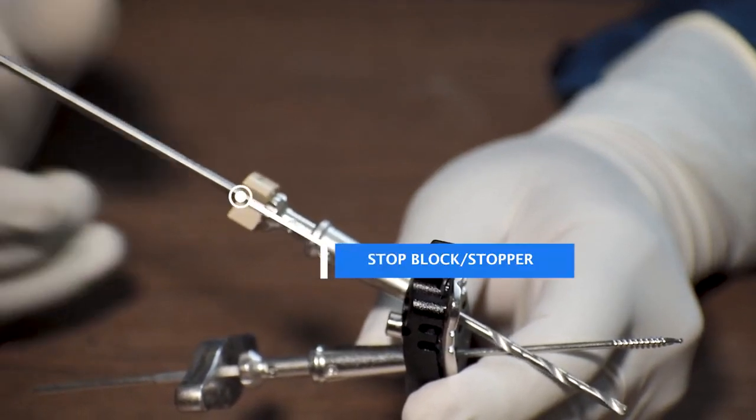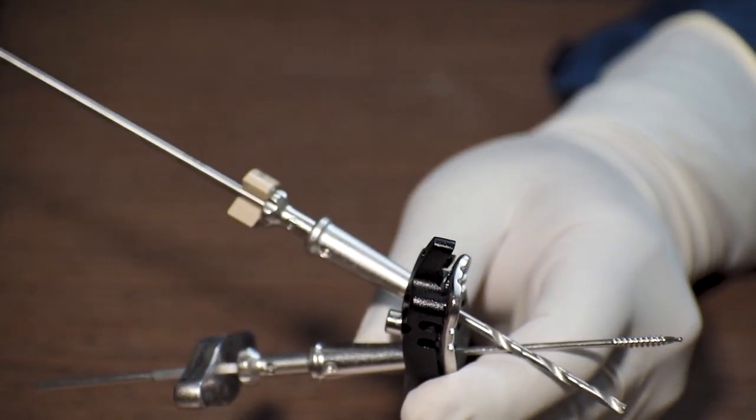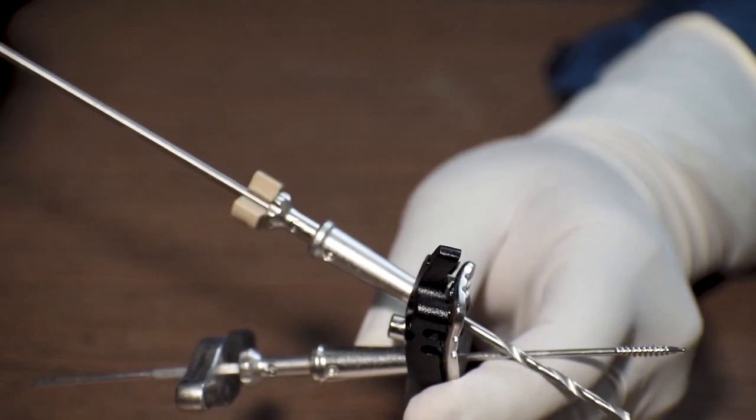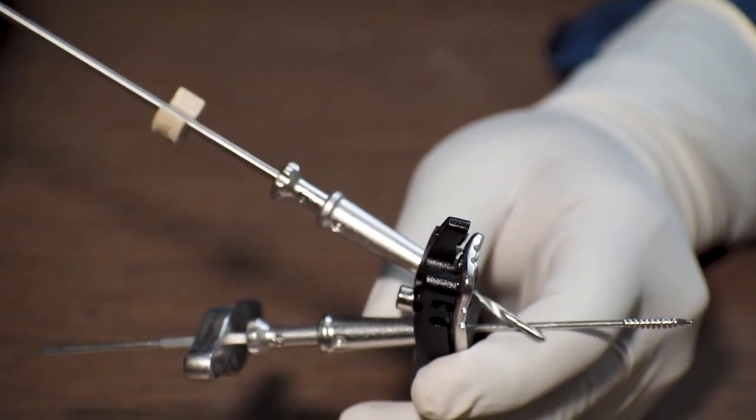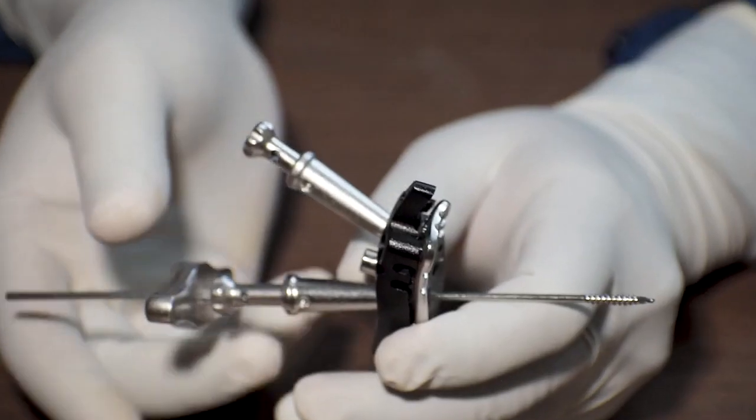This is called a stop block or a stopper. We will drill till it touches the drill sleeve, and then we will actually take the measurement of the required length of the screw that is needed to be fixed.